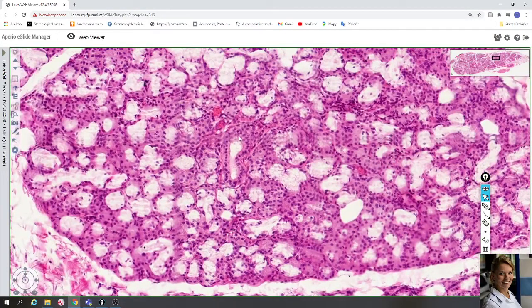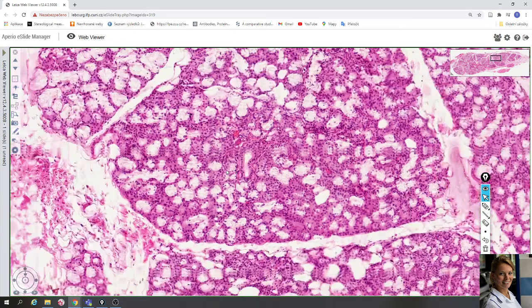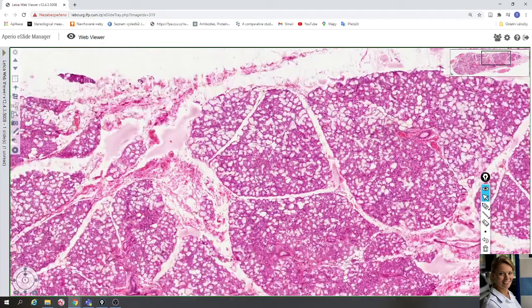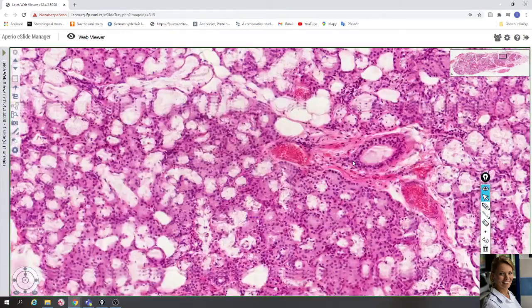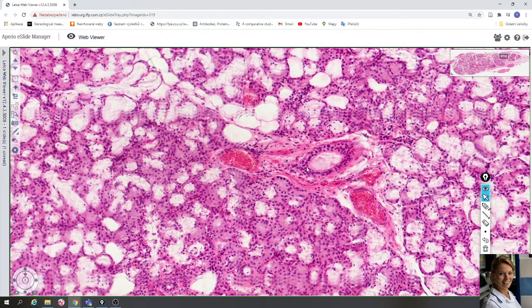Very rarely, striated intralobular ducts are visible; these are lined with one layer of columnar epithelial cells which have nuclei in the center, and their basal compartment contains a basolateral labyrinth — basal membrane folds with mitochondria. Larger ducts are lined with two layers of cuboidal cells and are surrounded by connective tissue. Here you can also see a blood vessel filled with erythrocytes.